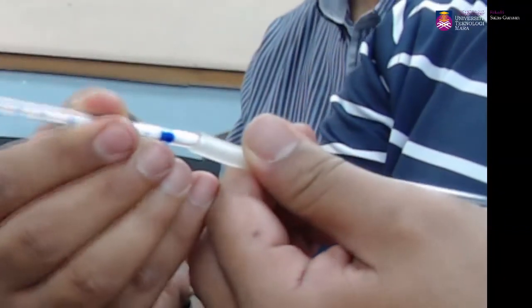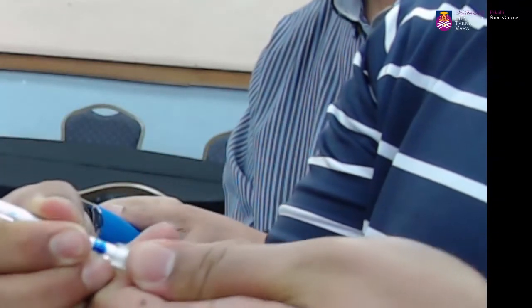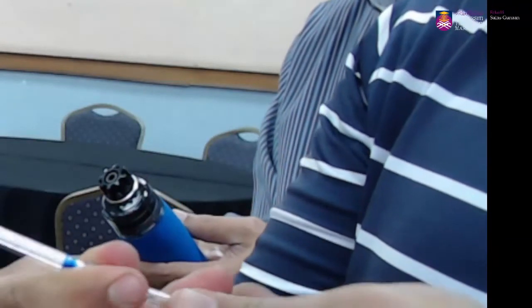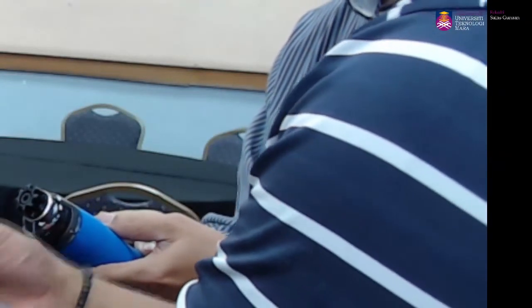Okay. So daripada sini kita ensurekan dia punya arrow tu sama, tak perlu kita align for both lah. Arrow sama, just connectkan kedua. Okay. So I rasa tak perlu zoom in already. Usually daripada sini dia dah fully inserted and then dia tak senang tercabut, okay lah. So kita just tahu, boleh check lah from here.